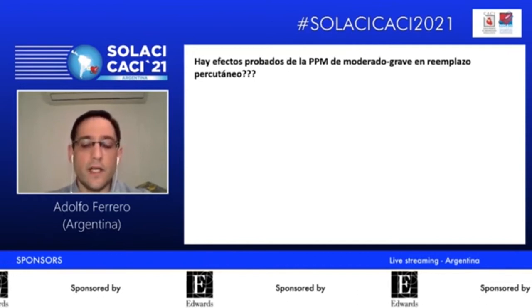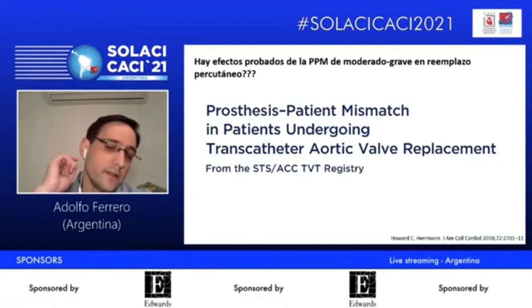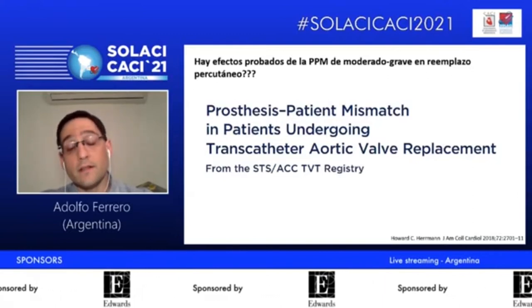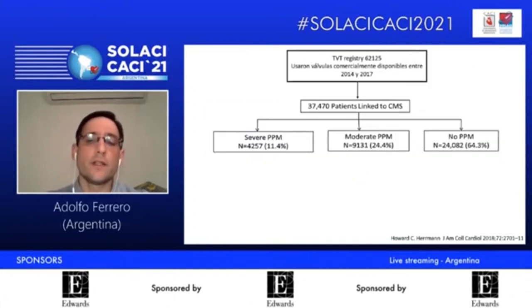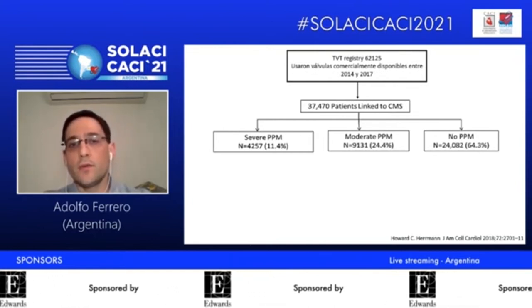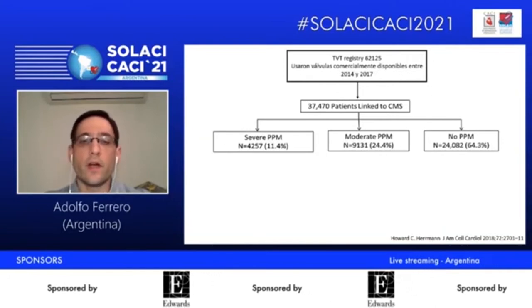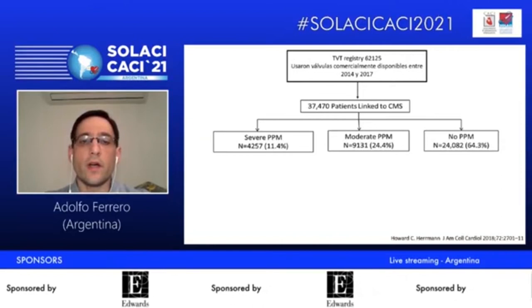But are these problems present in the TAVR field? Well, let's look inside this trial, which says yes, that there is a problem. I am not sure, but let's analyze together and then discuss after all. You can see here the TVT registry, which has more than 60,000 patients.